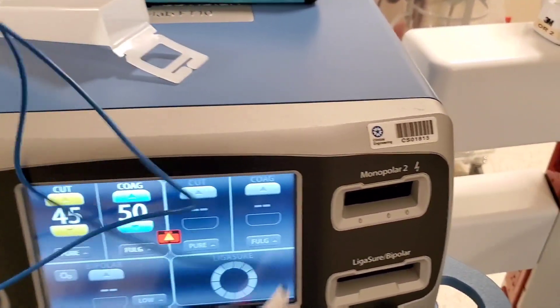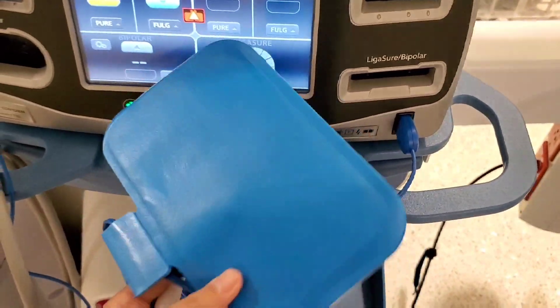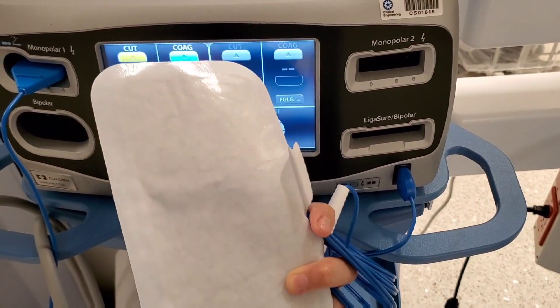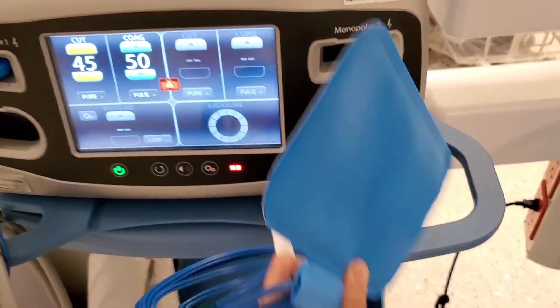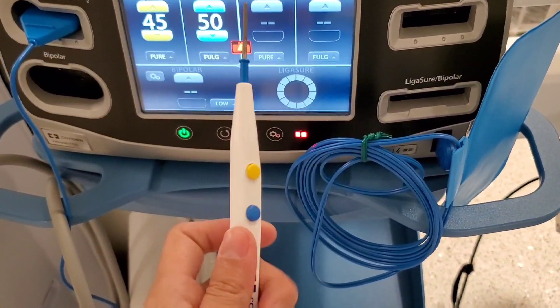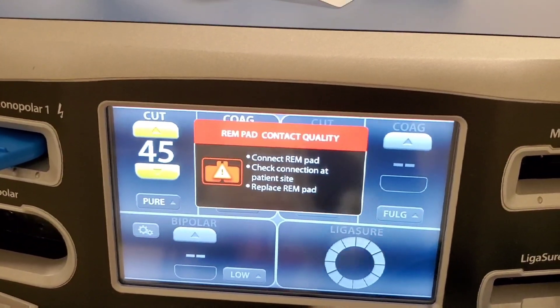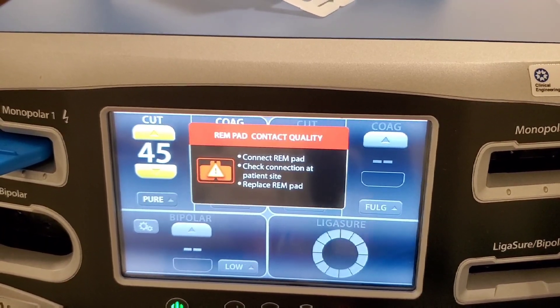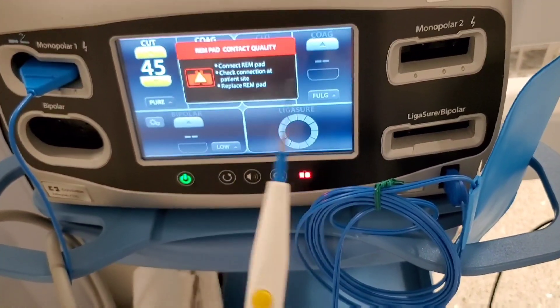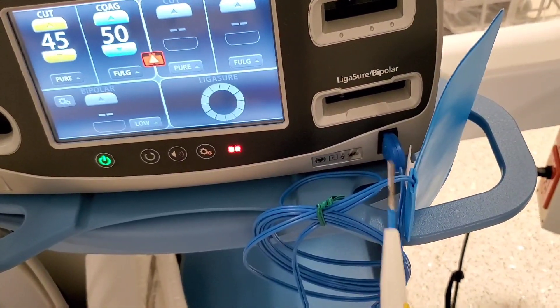So once that's plugged in, let's try to see if it works. Just a disclaimer — the bovie does not work if a bovie pad is not attached to the patient. So let's see what it would say if we press on it. It says: REM pad contact quality, connect REM pad, check connection at patient's site, and replace REM pad. So just as I suspected, you cannot use a bovie if the bovie pad is not connected.